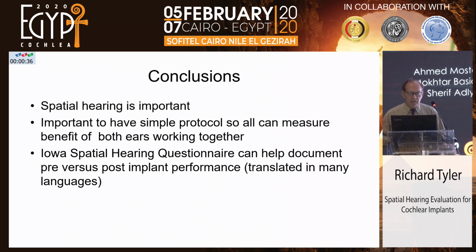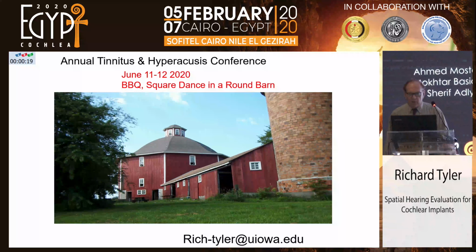So spatial hearing is important. It's very important to have a simple protocol so we can all measure benefit of both ears working together. And we recommend the Iowa Spatial Hearing Questionnaire to document pre- and post-implant performance. And it's already been translated in several different languages.